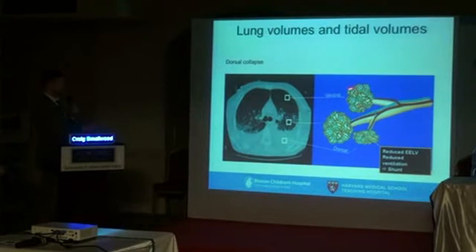So here's a cartoon to kind of illustrate what the distribution of ventilation looks like across those three images of the lung. We're going to have up here probably a little bit of overdistension, which may reduce pulmonary blood flow. So ventilation without perfusion equals dead space. And then here we can have some areas where we might have reasonable gas exchange or a reasonable match between ventilation and perfusion. And down here we really have just a shunt, right? It's essentially we're only going to be having blood flow to that region, and there's no aeration, so no gas exchange.